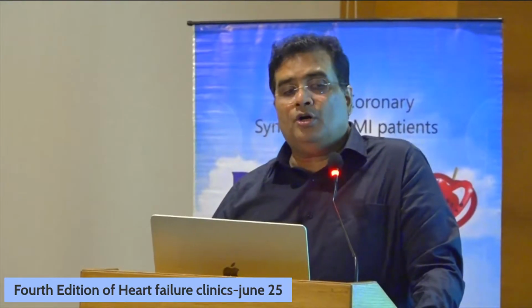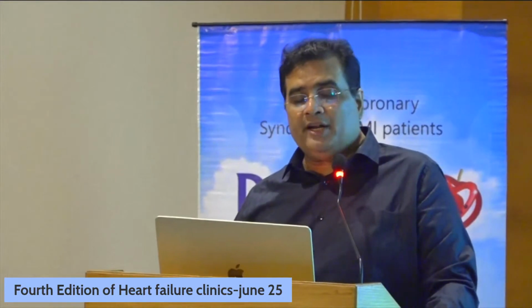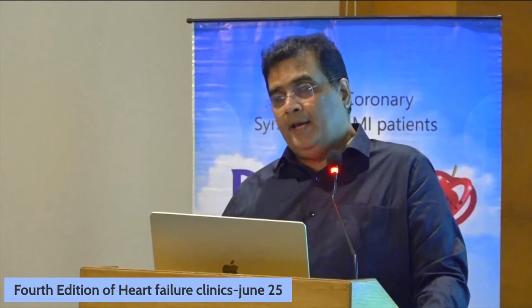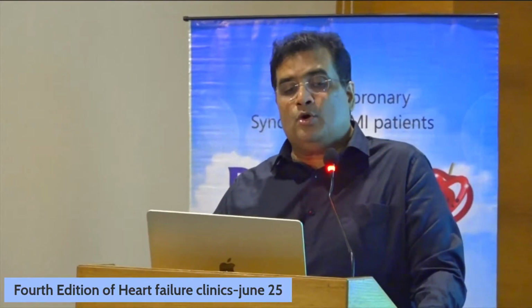Now let's go on to the stress echocardiography. Stress echocardiography for detection of ischemia. This stress echocardiography can be done with an exercise stress test or with a dobutamine stress echo. But majority of the time in our country, in our geography, we do a pharmacological stress test. When you go to the Western countries, especially the US, they do a bicycle ergometer and do a stress echocardiography with a bicycle rather than a medication.